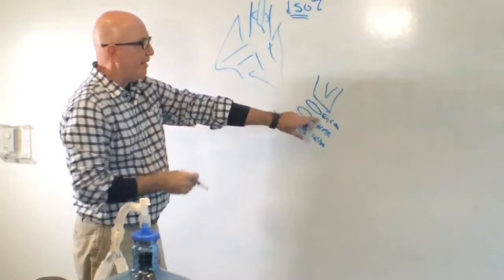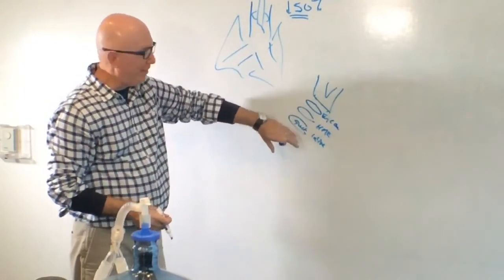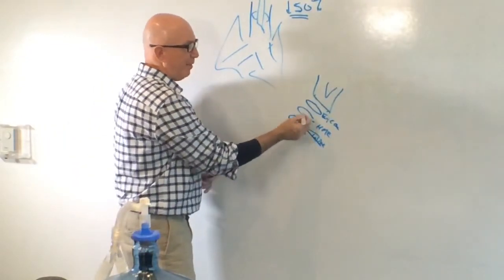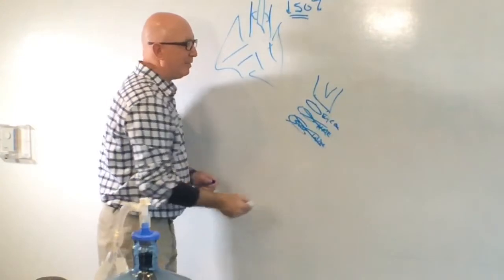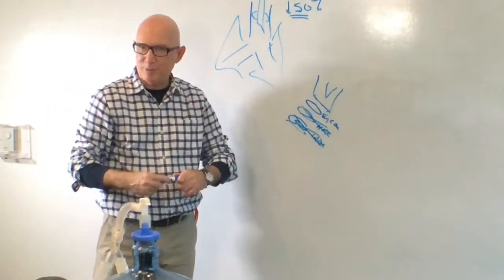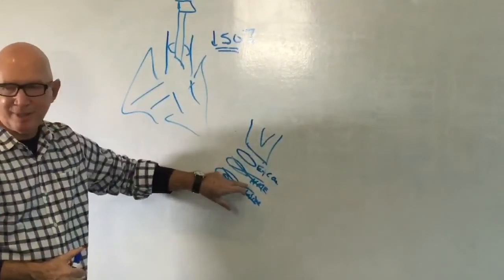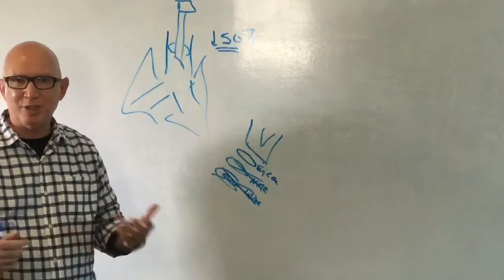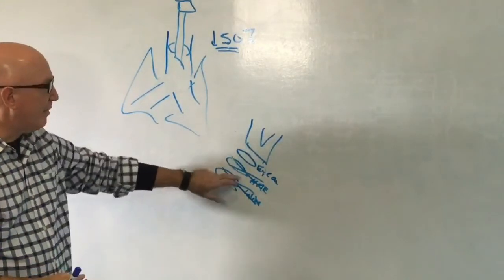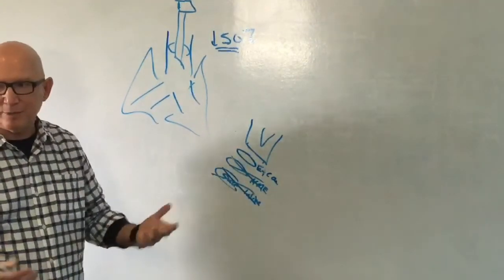I would argue that the end-tidal CO2 is important. Actually, I would argue all these are important, but if I had my choice, I would take this one out first. I know that we also take out the HME, but quite frankly, if you've ever had surgery and been ventilated for more than 30 or 60 minutes without an HME in place, you can feel how uncomfortable your chest is after that period of time breathing dry, cold gas. But nevertheless, if you can't ventilate effectively with that in place, then taking it out can give you more effective ventilation.